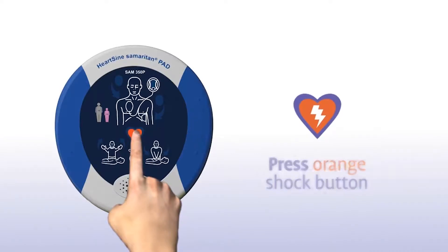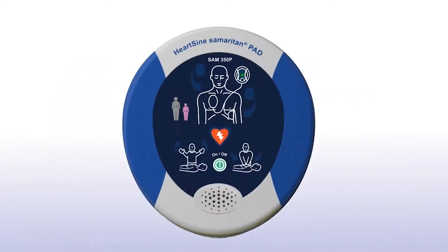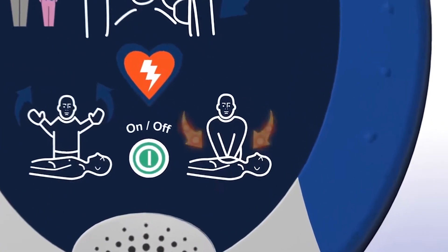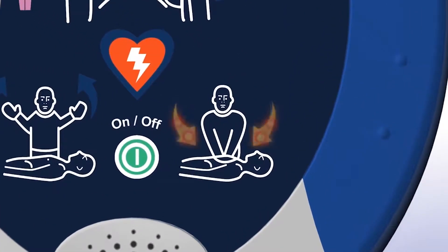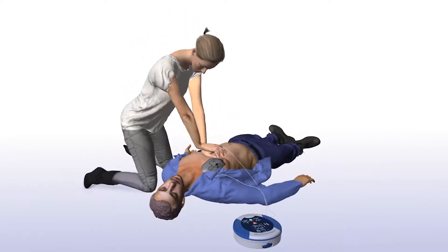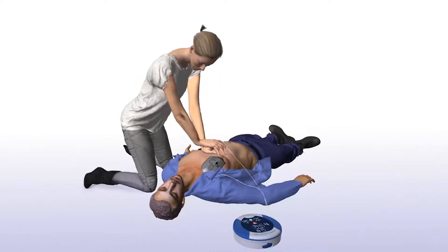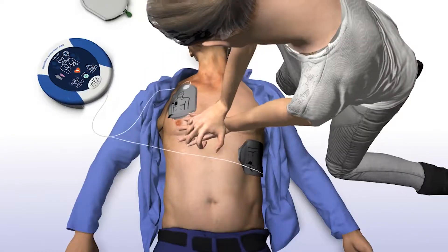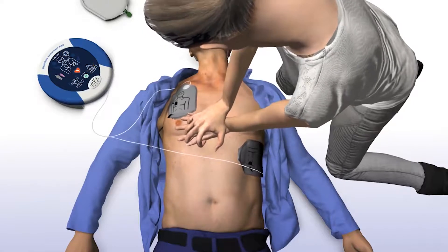Press the orange shock button now. Shock delivered. When performing CPR, it's important to apply effective chest compressions for each 2-minute cycle as directed. The Sam 350P will prompt you to begin CPR. Begin CPR — it is safe to touch the patient. The Sam 350P will tell you how and where to place your hands and instruct you to keep in time with the metronome. Place overlapping hands in the middle of the chest and press directly down in time with the metronome.